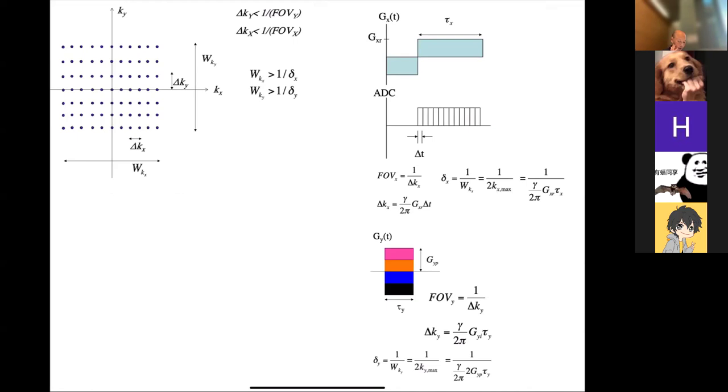The main thing to keep in mind is that anytime we're talking about sampling in K-space, it's related to the FOV. And anytime you're talking about how wide you go in K-space, that's typically related to the resolution. The other design problem that comes up quite a bit in MRI is if you have your GX gradient and your GY gradient. In the homework and the pre-lecture quiz, there are these dephasers, whose job is to take you out to some initial place in K-space.